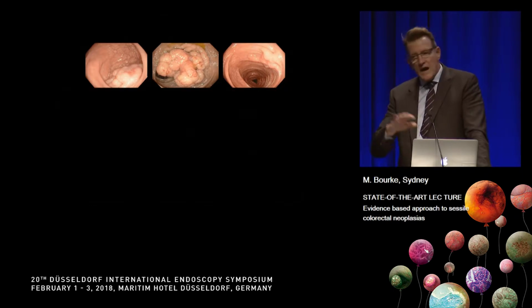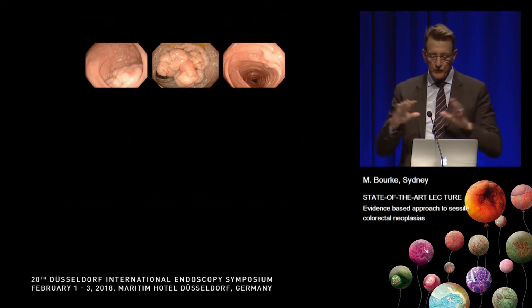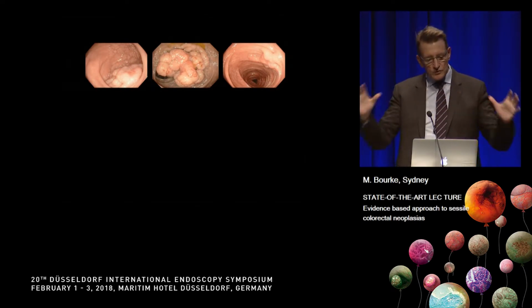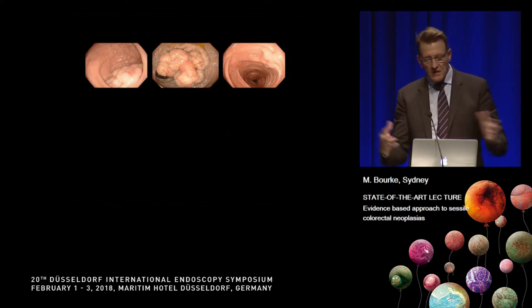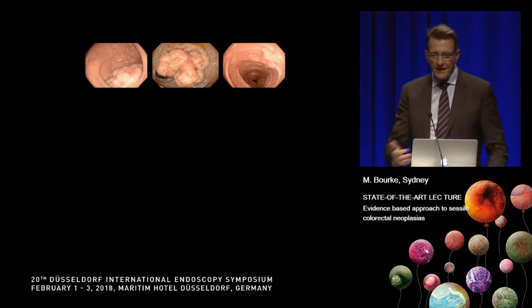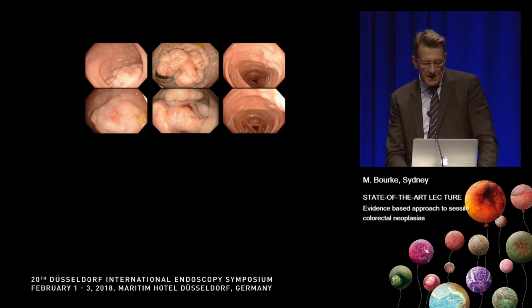When you look at a large sessile or laterally spreading lesion, if it's benign, it should have an overall sense of homogeneity. In other words, there should be no obvious depression or large bulky nodule that's a different colour or has a different surface pattern. That's a very simple rule, but you see here, these are 3 lesions sent to our department for endoscopic resection, and when we look in overview in every single case, we can see the loss of homogeneity in these areas.